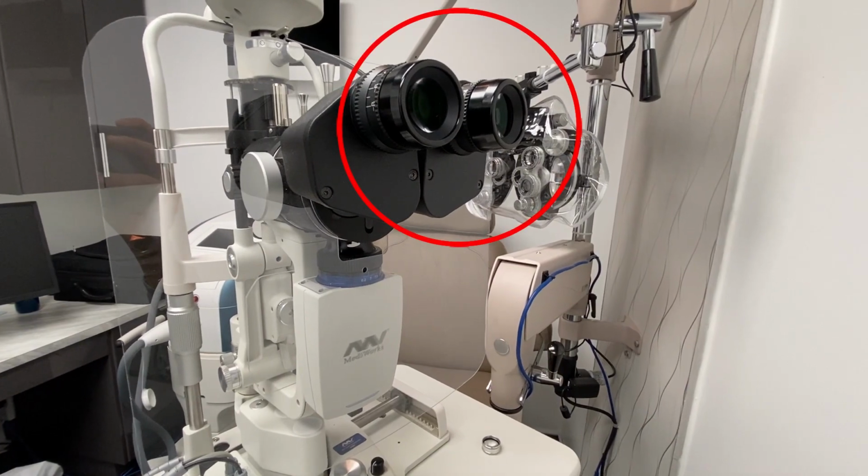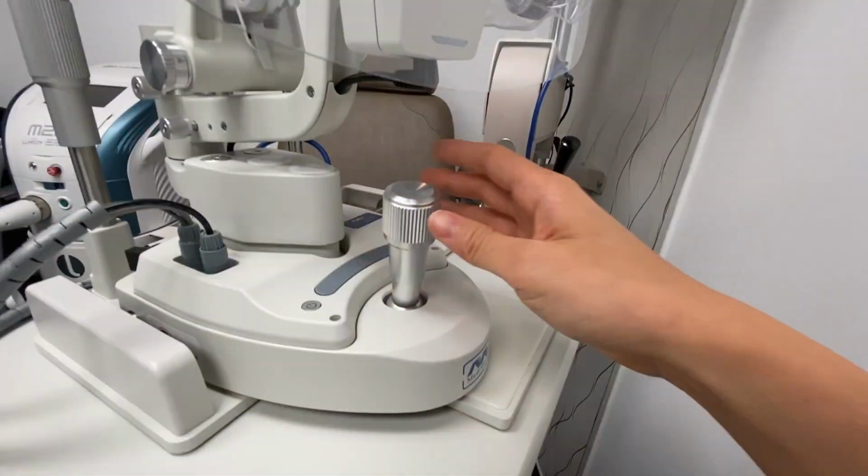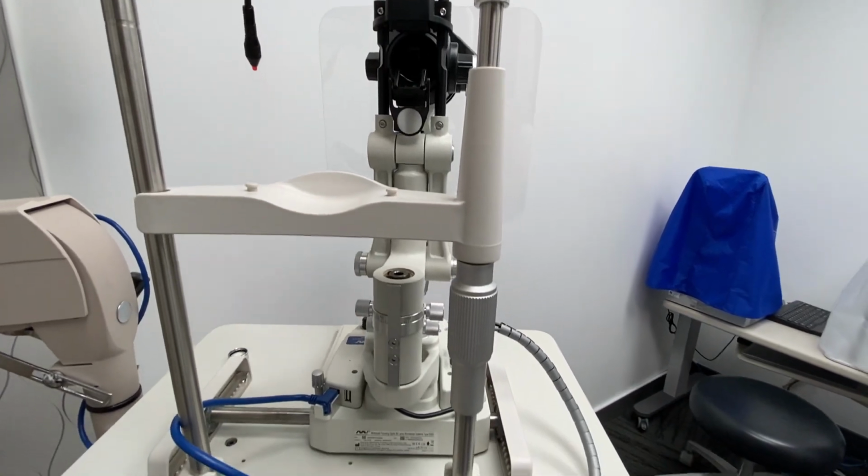There are numerous options when it comes to slit lamp microscopes, and they are generally equal across the board in terms of everyday function. Now, the general parts that every slit lamp has include the observation system, the illumination system, and the mechanical support system. The observation system is where your optometrist or ophthalmologist looks through and in essence is a compound microscope with the objective lens and the eyepiece. The illumination system, of course, provides the bright and even light to expose the ocular tissues.